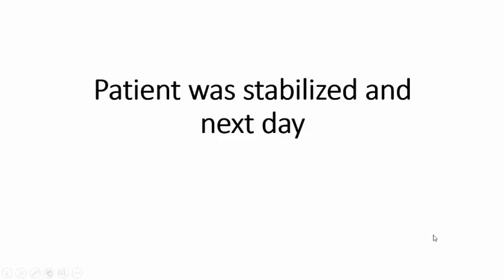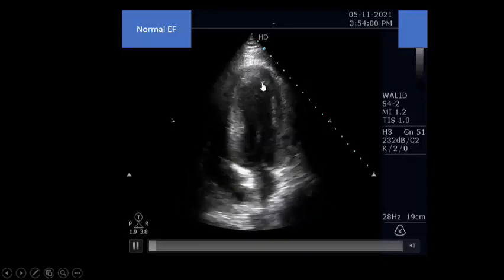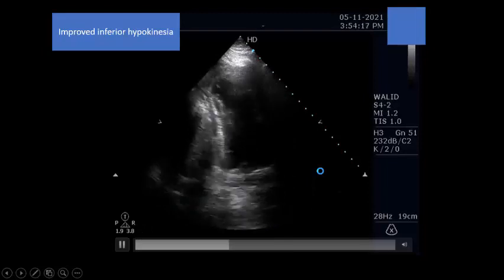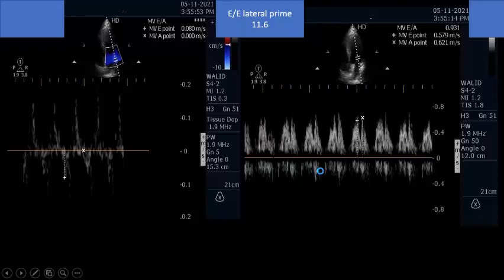The patient was stabilized with IV fluids and inotropes. The next day, the lateral wall was contracting normally, akinesia improved in the septum, and in the two-chamber view the inferior wall hypokinesia had improved. IV fluids were guided by an increase in stroke volume with no critical rise in left atrial pressure. We targeted stroke volume while monitoring lung water with A-lines — we needed to perfuse the patient with fluids, but not too much. The hallmark of hemodynamic management in heart failure is: give fluids but avoid pulmonary congestion.